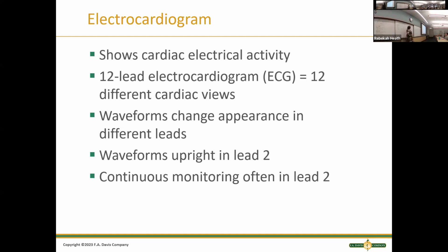So up here, this is our patient, and we've got a lead up on their chest. Our view is looking down like this. Now, if we have a lead down here on the legs, that view is looking up this way. So it's just a different point. So make sure you know which lead you're looking at.